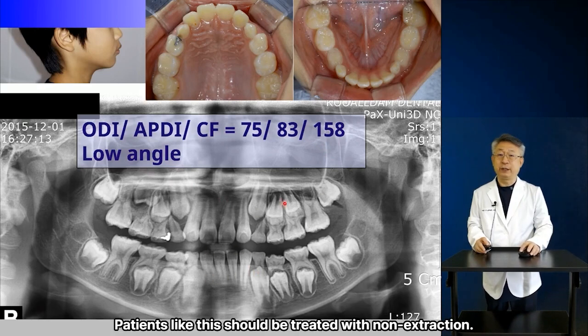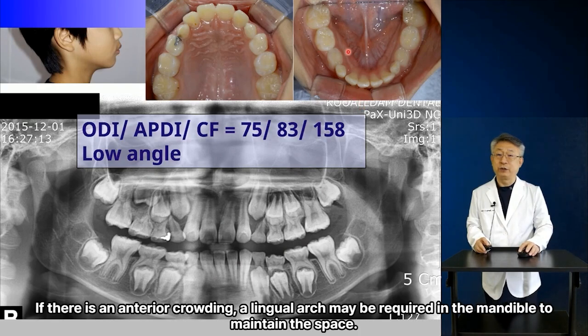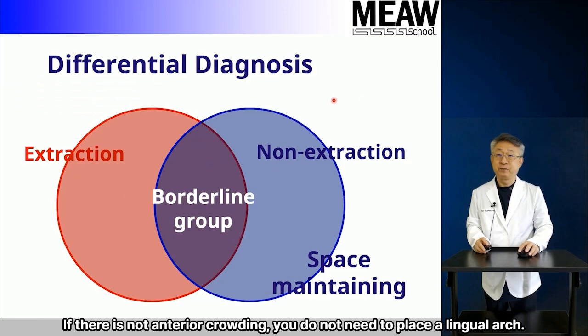Patients like this should be treated with non-extraction. Fortunately, this patient does not show anterior crowding. If there is anterior crowding, a lingual arch may be required in the mandible to maintain the space. If there is no anterior crowding, you do not need to place a lingual arch.